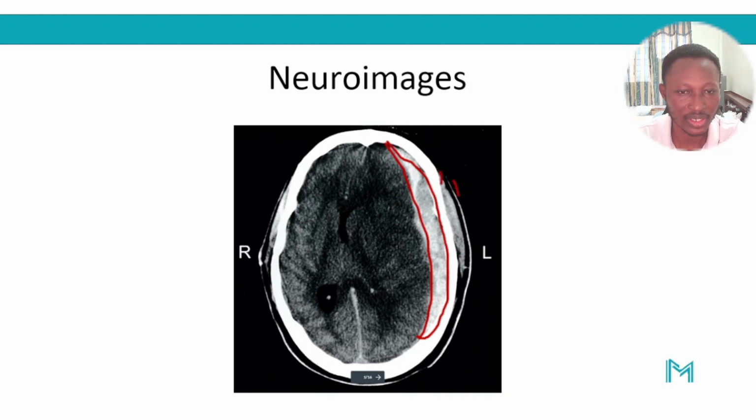This is the skin of the scalp, but there's this other hyperdense collection here. This is an extracranial hematoma that is also collecting within the scalp. And then you have this intracranial bleed, so this is another example of an acute SDH.